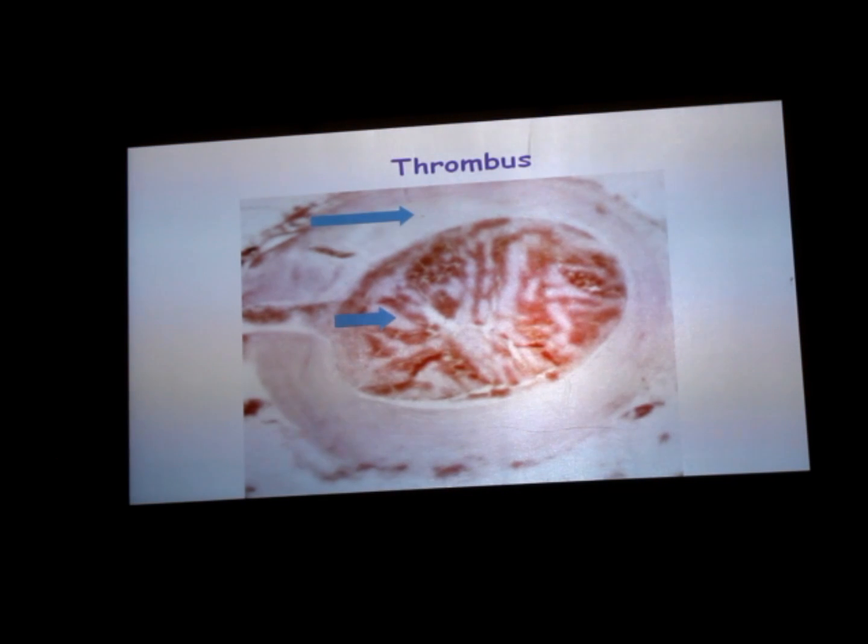So this picture is about a thrombus inside the blood vessel. It is formed from the constituents of blood. Whatever is present in the blood, the cells, the proteins, it is formed from these constituents. It is just like a clot which is formed inside and it is abnormal, pathological. Normally whenever there is any injury, there will be bleeding and a clot is formed outside to stop the bleeding. Thrombus is like a clot which is formed inside a blood vessel whenever there is some injury to endothelium. Okay, or as I said, the other 2 things.